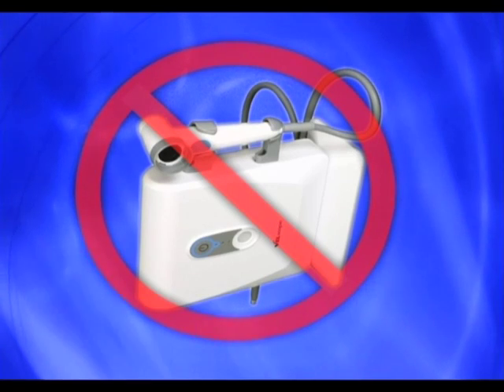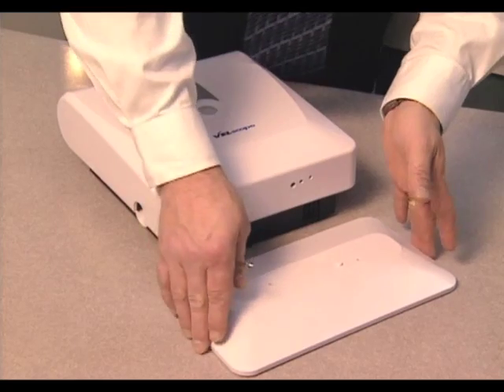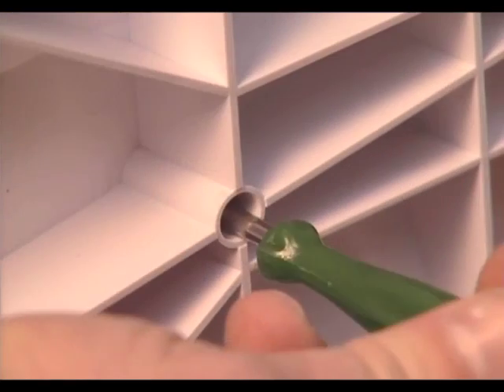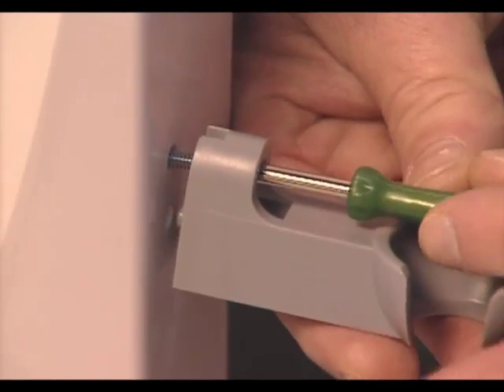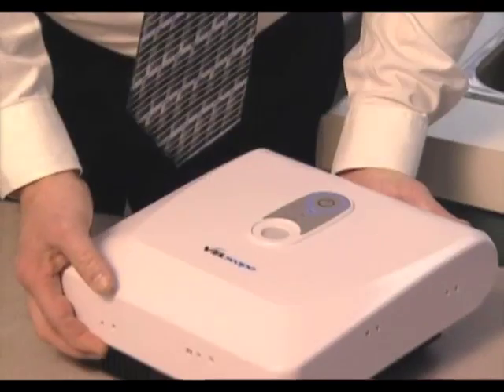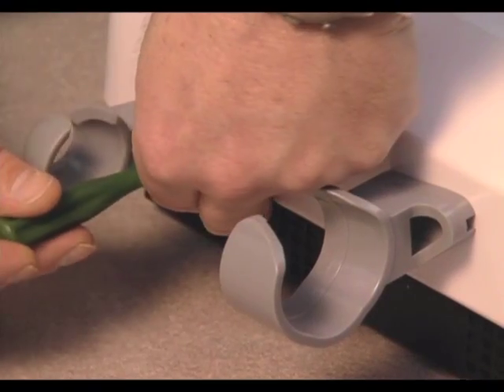Never operate the Velscope system with the LSU positioned on its side, neither right nor left, as doing so may cause damage to the lamp and unit. To assemble the LSU in the vertical orientation, insert the pin on the base stand into the mating hole on the underside of the LSU. Insert screws and tighten until secure; be careful not to over-tighten. To attach the handpiece brackets, stand the unit up and insert the pin that extends from each bracket into the mating holes on the side of the LSU. When the LSU lies horizontally on the counter, it does not require the stand base. The steps to attach the brackets are the same as for vertical orientation, except they are screwed into the bottom of the LSU.